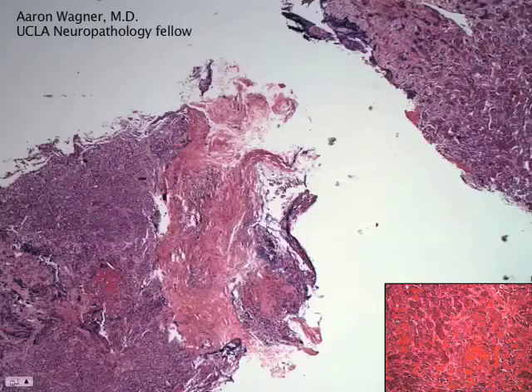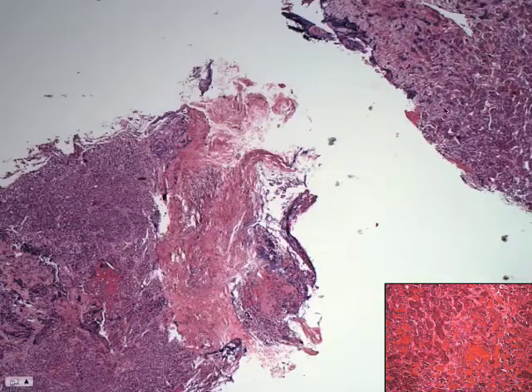The first slide shows the contrast of what we got. The normal tissue is up here in the upper right corner. Adenoma, mostly adenoma, is here in the lower left. We did do a reticulin on this, and you might want to keep this pattern in mind because it gets a little bit confusing in the stains.